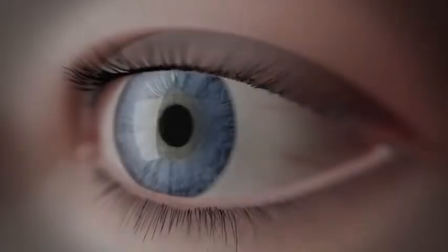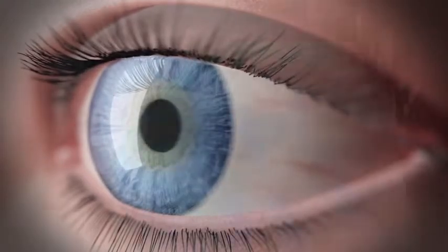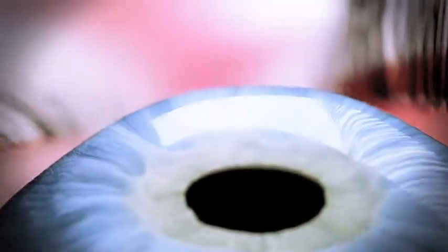LASIK's always a two-step process, and it's the first step that nobody likes to talk about. The first step of the procedure is to make a flap on the front surface of the cornea. Now there's a reason we have to do this.